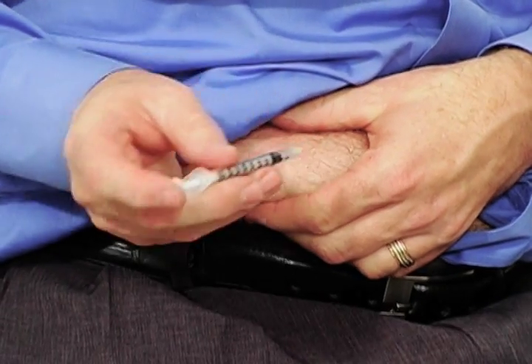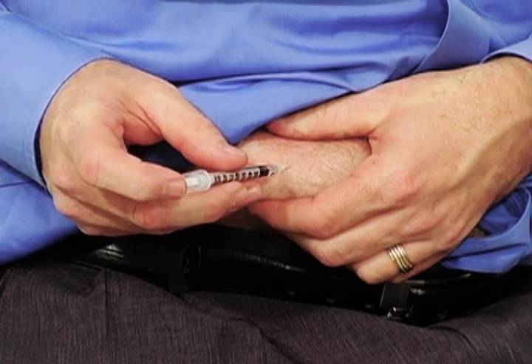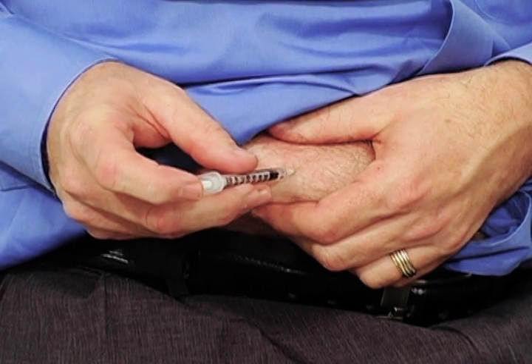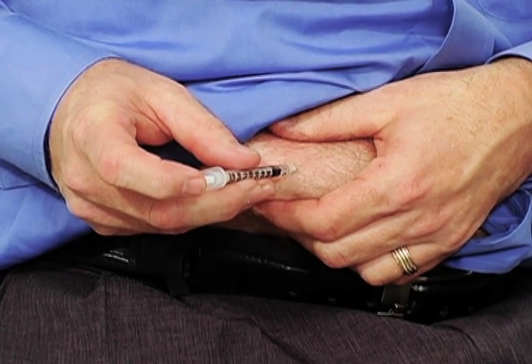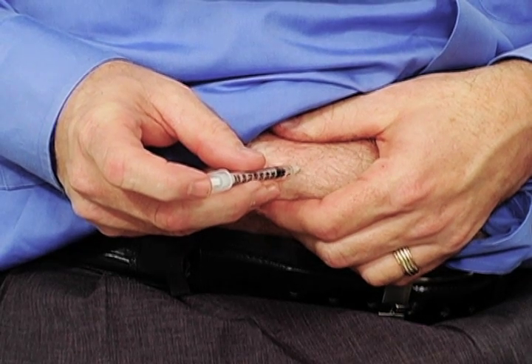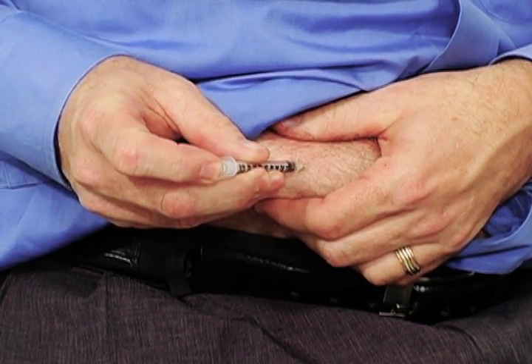Great. Now you're going to pinch your skin, pull it away, and place the needle against it. Stop right there — do you feel any pain, just a little bit of pressure, or nothing at all? Nothing at all. So if you apply a little bit of pressure, you'll find that the syringe goes all the way in.